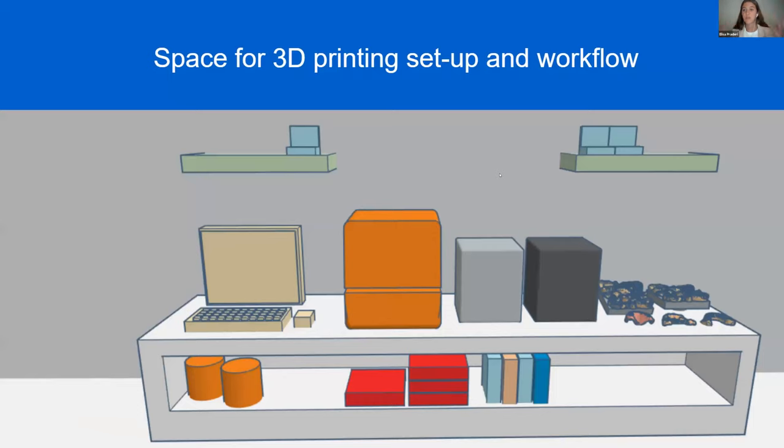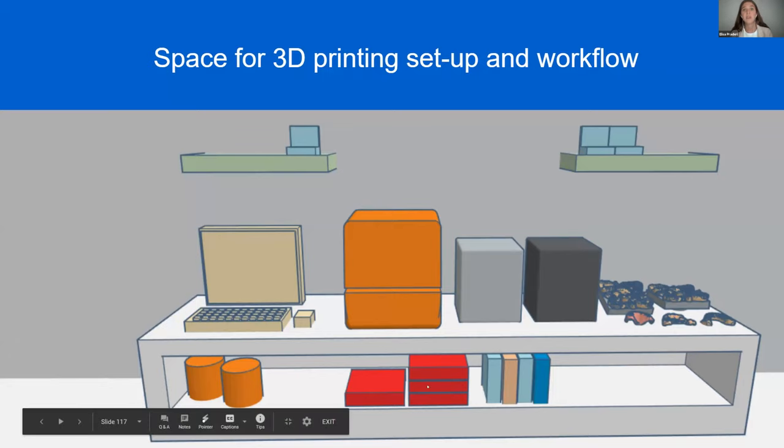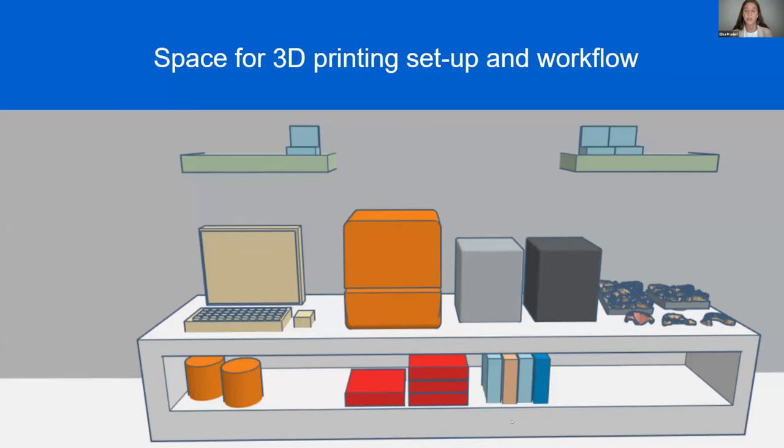So for example, for 3D printing specifically, it is very important to bear in mind this space that I was talking about. And so it's very good for practice management and space organization to have a dedicated space for your design station, as you see here: the printer, the wash, the cure, and an extensive post-processing area where we can remove the parts with all our accessories, cartridges and resin tanks, very easy to change with a printer. And so you need to consider a little bit about these things.